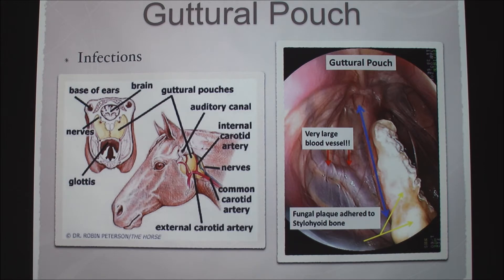You can check the pouch with a scope — before you enter the horse's trachea, there are two little skin flaps and you can take the scope inside them and look around. You have to be extremely careful and usually just put the very tip of the scope in, because if you nick the carotid artery the horse can bleed out. They also have lots of nerves in this area along the surface, and obviously you don't want to nick any nerves because that can cause permanent damage.